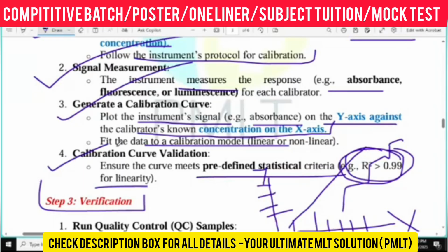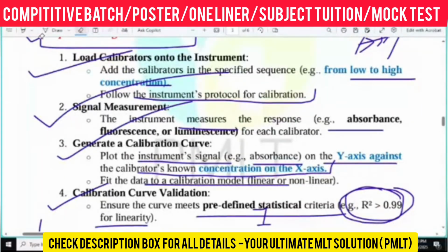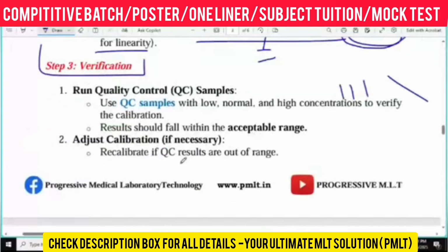Now it is high time to discuss the verification step. Firstly, we have to prepare the things here. After that we have to run. After that we have to verify it. After that we will see the calibration graph here. Verification: run the quality control.